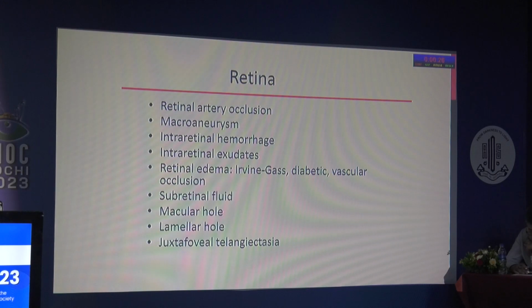You operate a good cataract, you have no problem, but the patient suddenly complains after 2 weeks or 10 days that vision has gone down. You are worried and you do an OCT and you find edema, then you can reassure the patient. Most of these patients will improve on their own. You just have to wait. Subretinal fluid, again, you have to pick up in many situations, and it has one indication, that these patients are going to recover better vision than with intraretinal fluid.